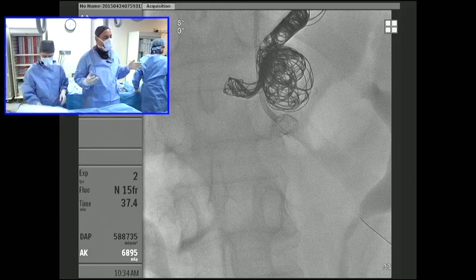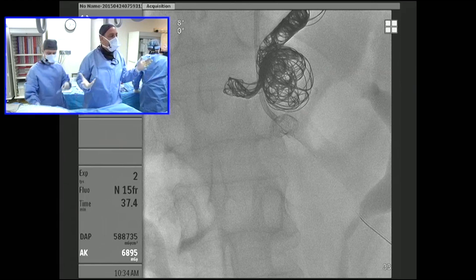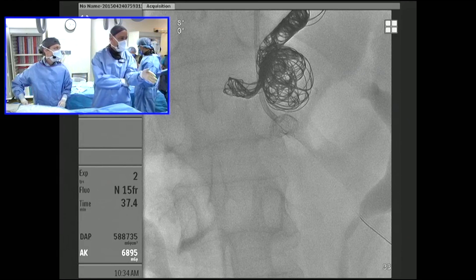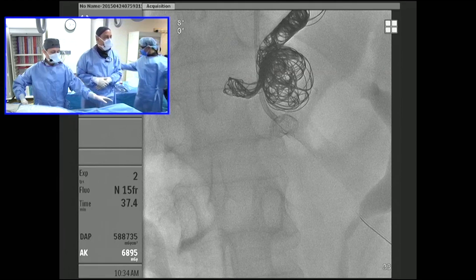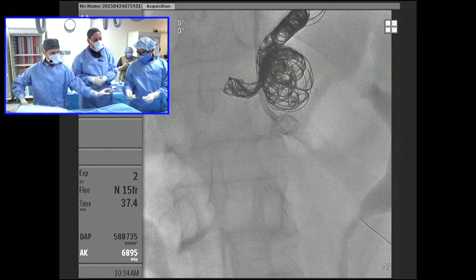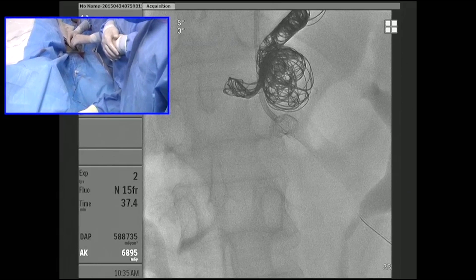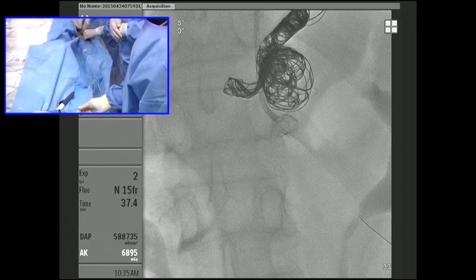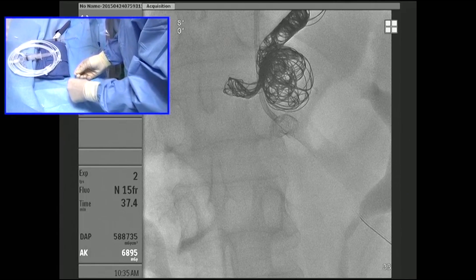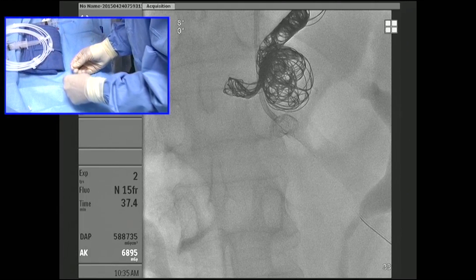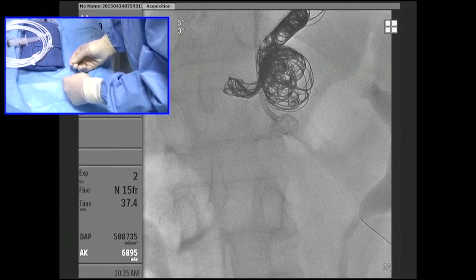These are really fantastically safe products that allow complex embolizations to be done with a level of safety we didn't have as recently as five years ago. Essentially making a hairpin turn and simultaneously trying to work up towards the head to engage the celiac artery and all the different branches — if we were to attempt this femorally, we probably would have lost access several times where the SMA wire would have prolapsed. With the very stable guide system from above, the wire in the SMA is very stable with not a lot of tension in the system.